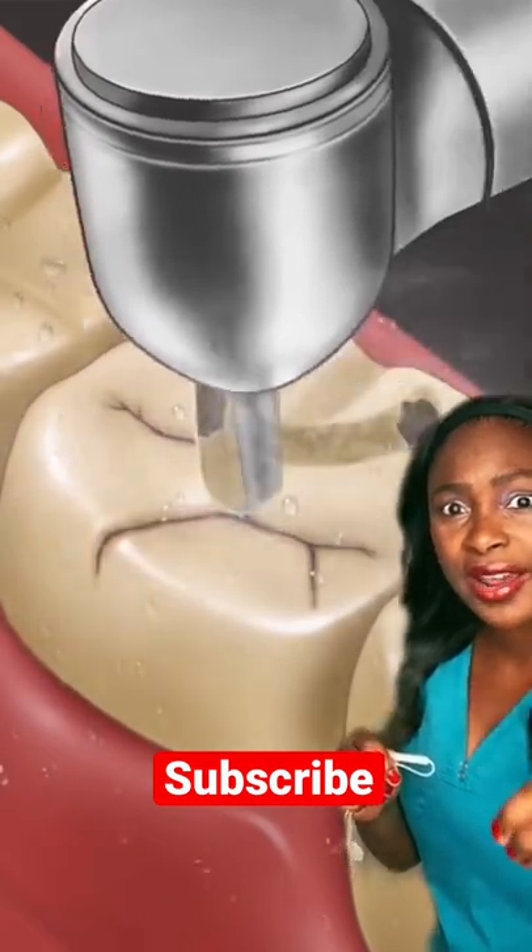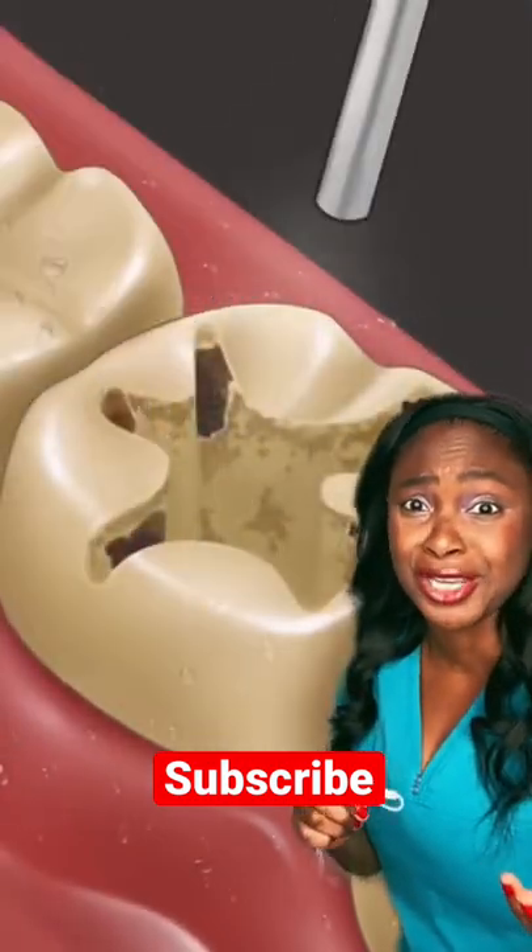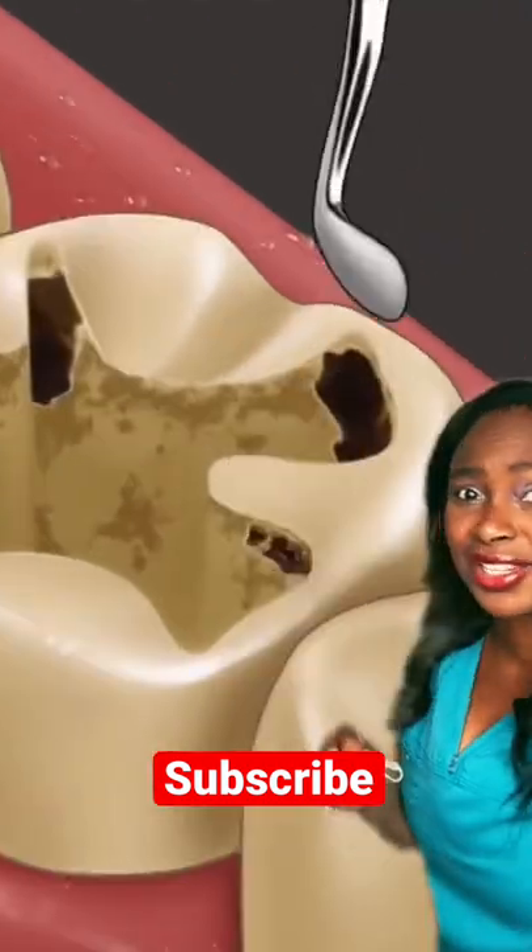They're going to drill out the cavity to clean everything out. Now they probably should have numbed up the patient first, but okay, let's just go with it.